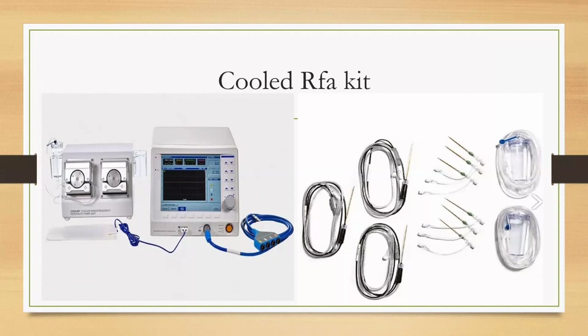Genicular nerve radiofrequency ablation for creating a larger lesion. Genicular nerve radiofrequency ablation for the knee. Okay, fantastic. Knee joint, shoulder, hip, and SI joint.